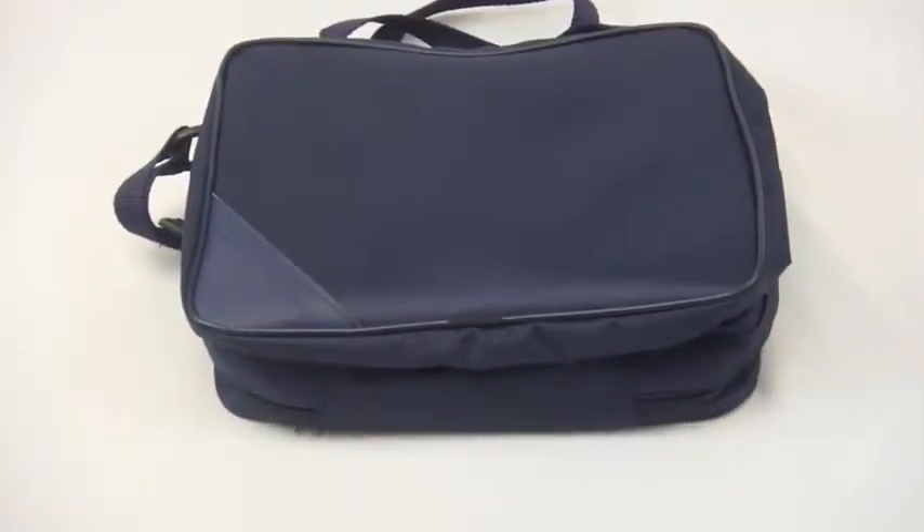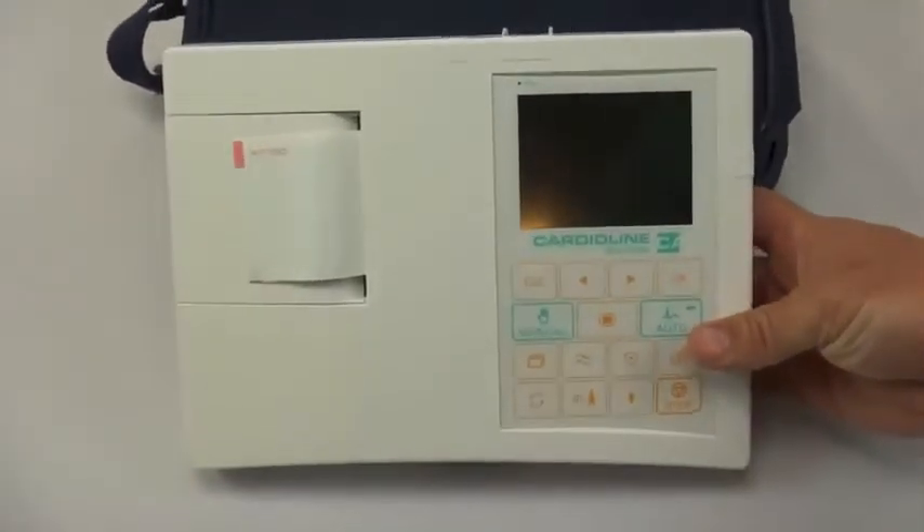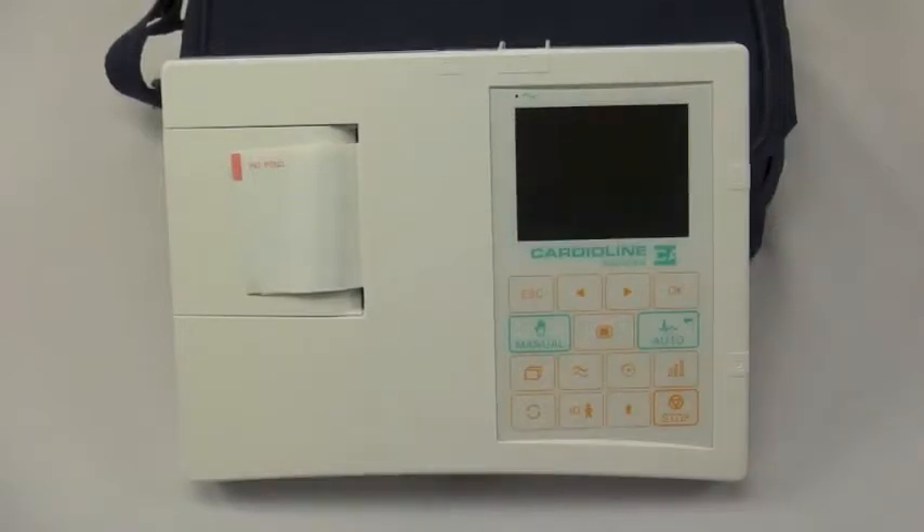You can store your patient cable and any additional items you would like to transport with the machine. It is quite handy. The machine comes patient-ready out of the box with all of the accessories you need to take an EKG. This is the CardioLine AR600 series from CardioLine US.